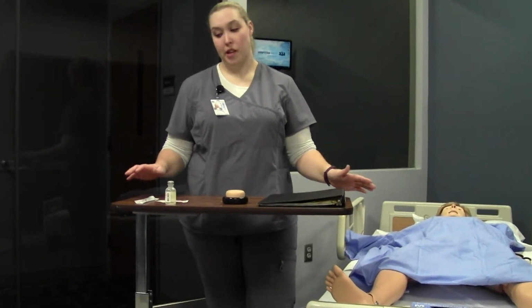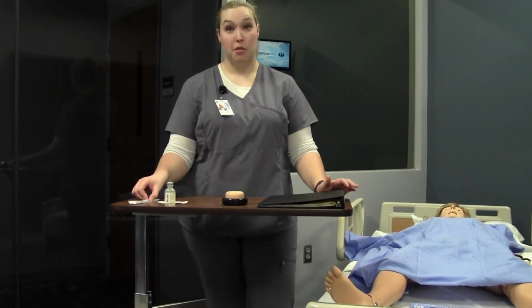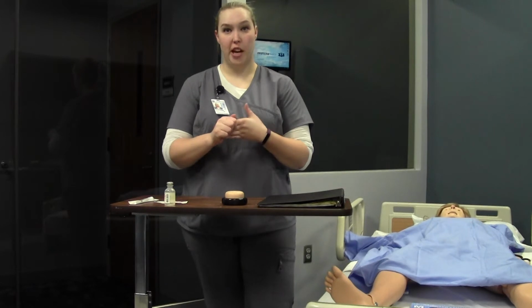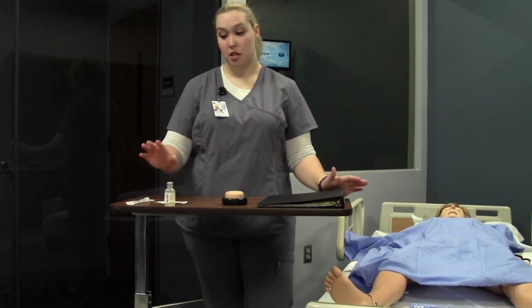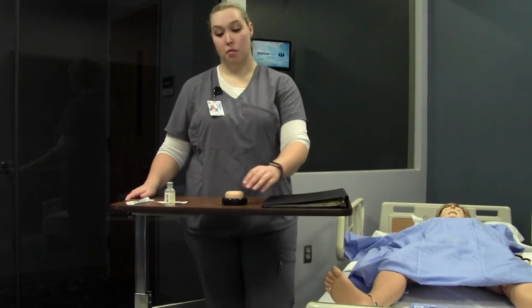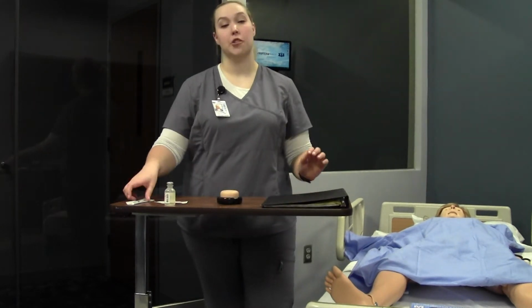Alright, today I'll be demonstrating intradermal injections. When you do injections, you need to remember your rights. So you're going to need your patient's chart. We have our little injection pads as well as the correct syringe.